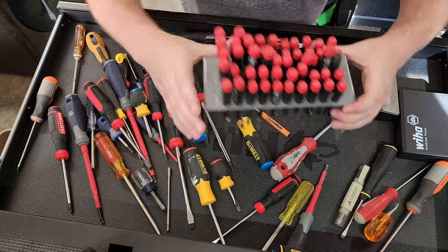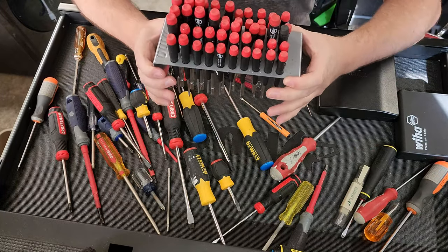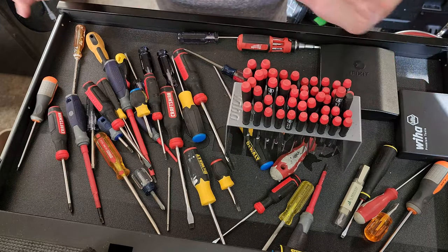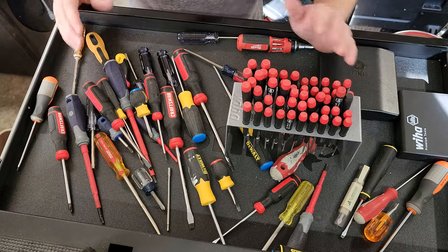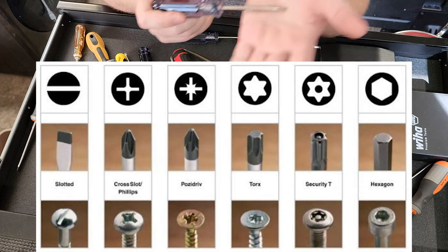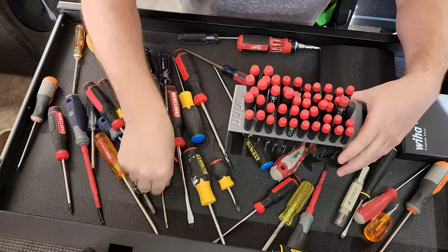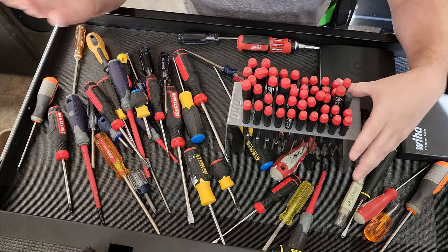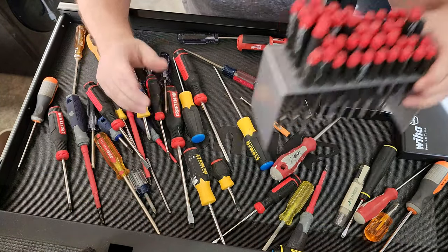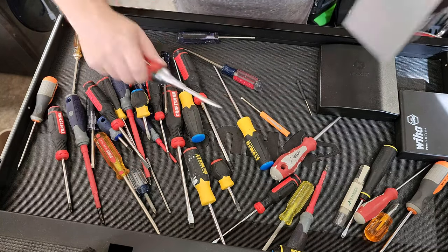If you need to work on electronics like cell phones and stuff, I use this Wiha kit right here — works fantastic. So that pretty much wraps up drivers. Just remember, your flat blade, your cross point, and your Torx are going to be the main ones that you're going to use on medical equipment. There are Allens and stuff like that as well, but for those I use multi-bits, and that takes care of them all in one spot.